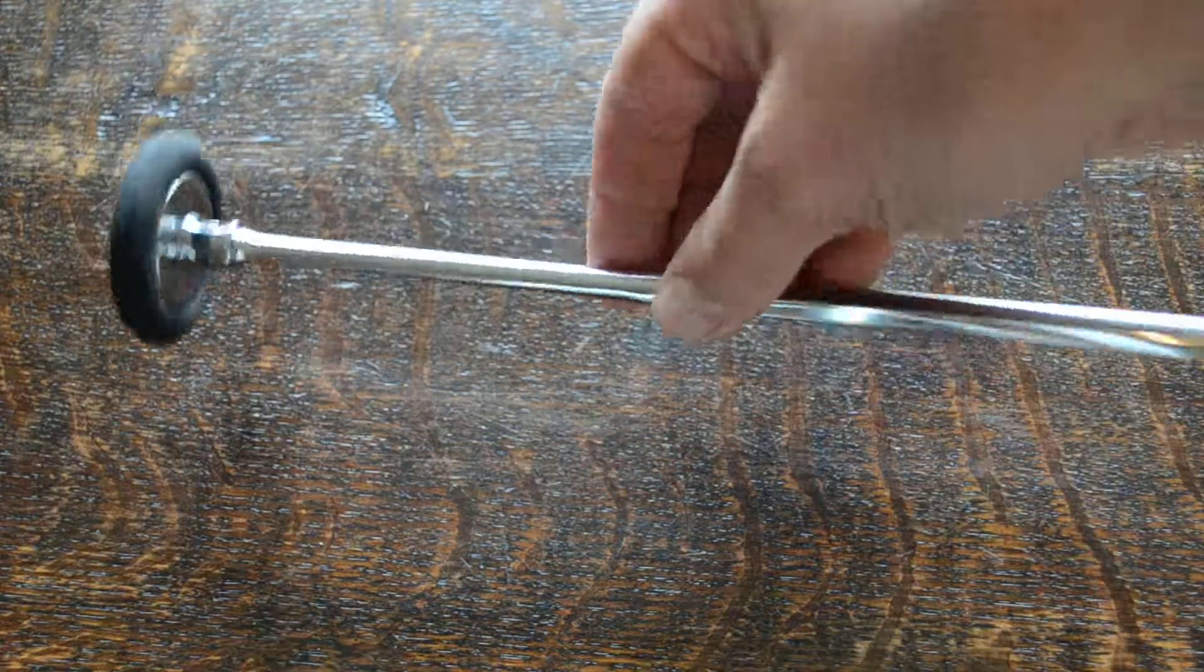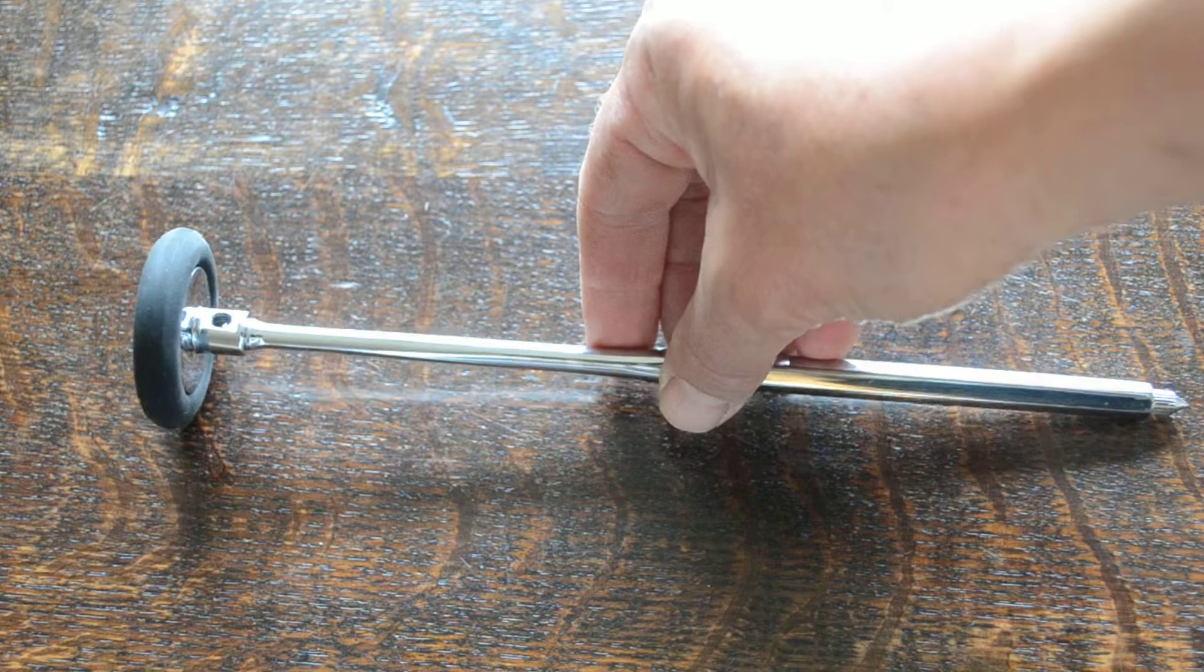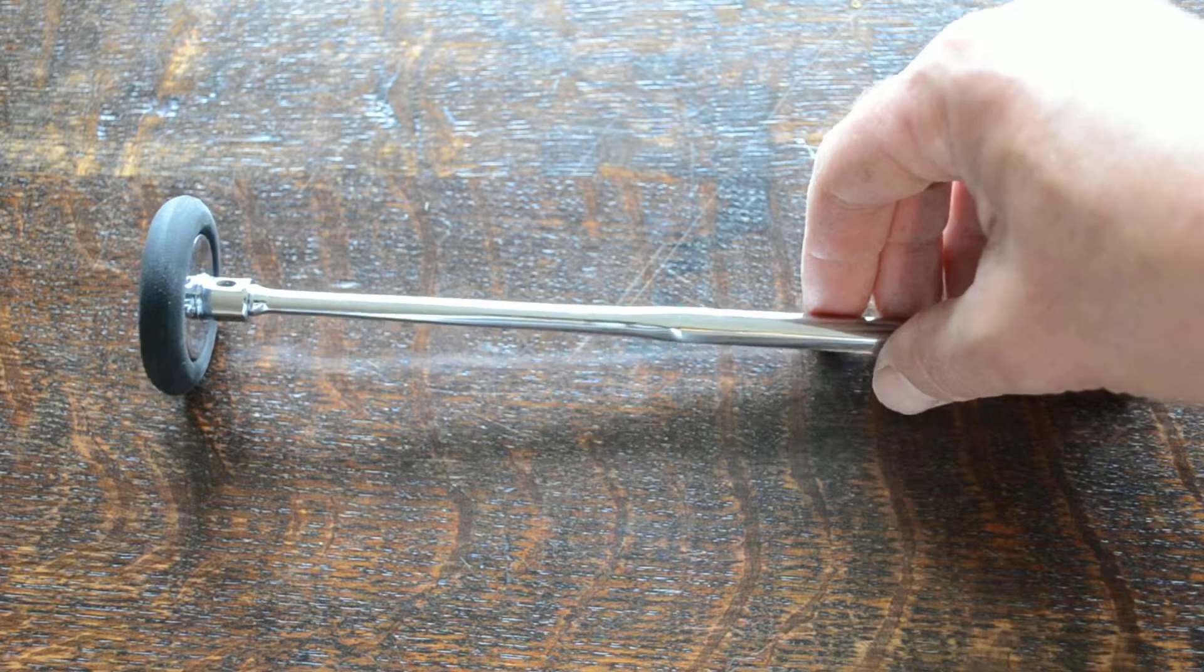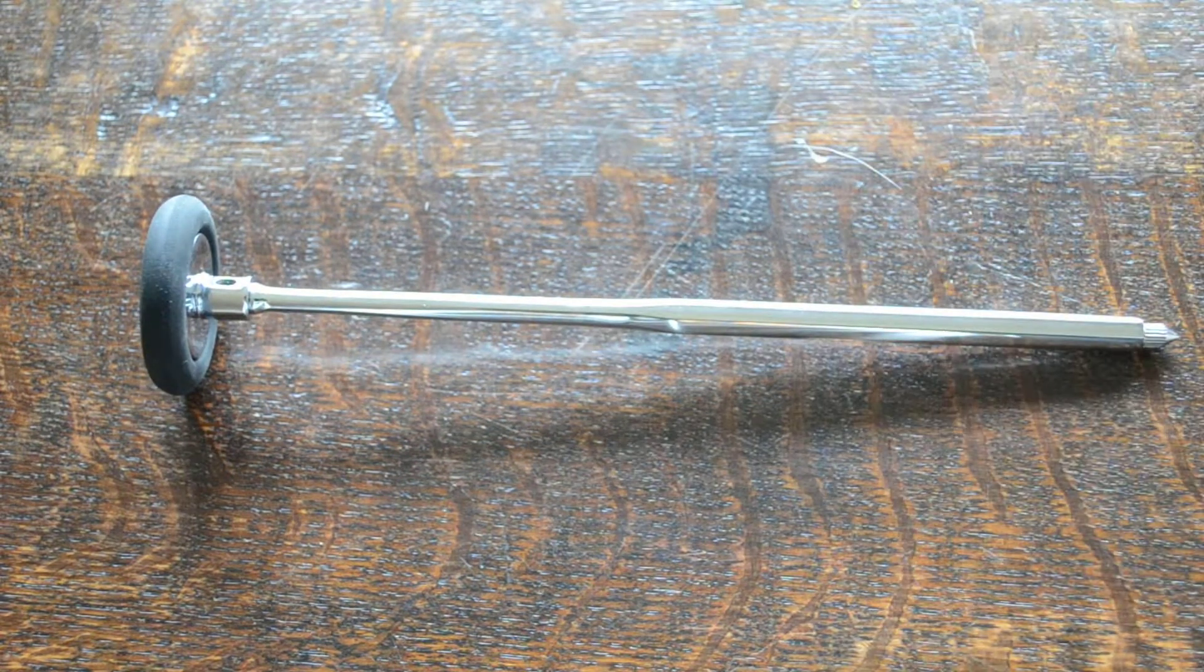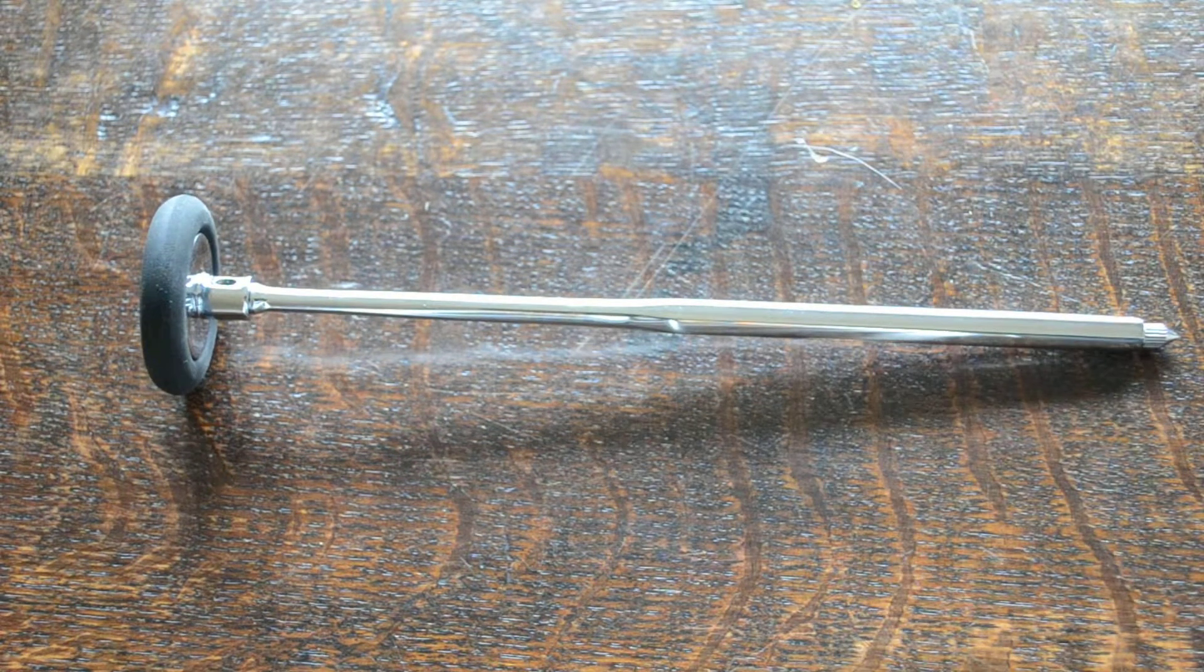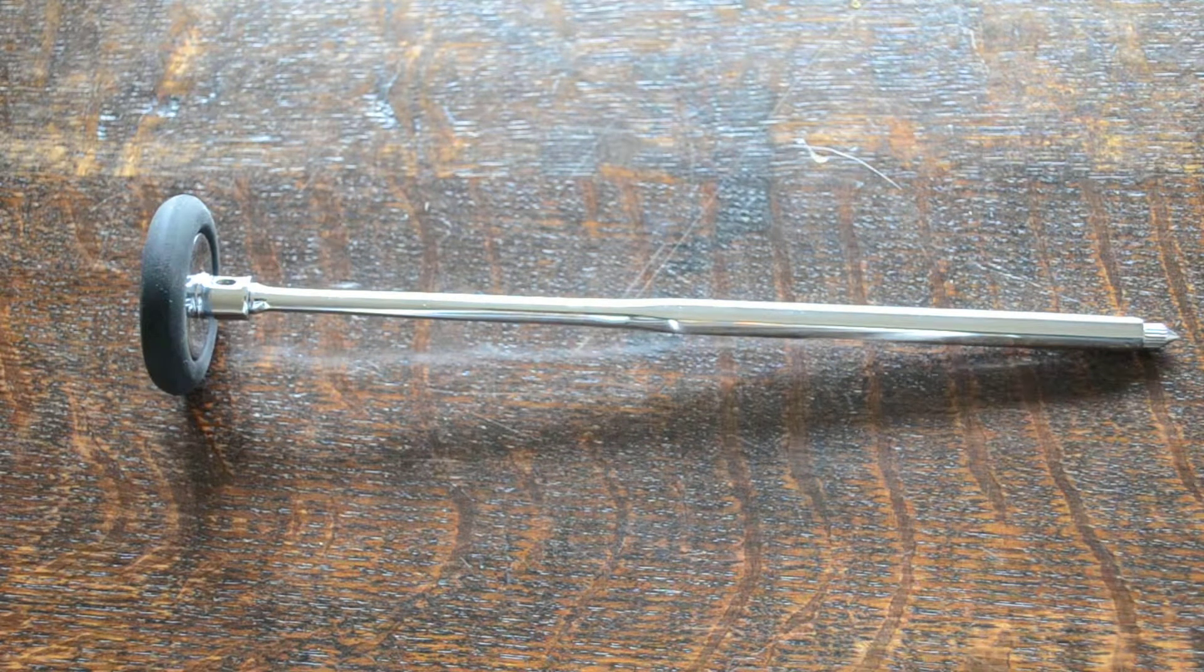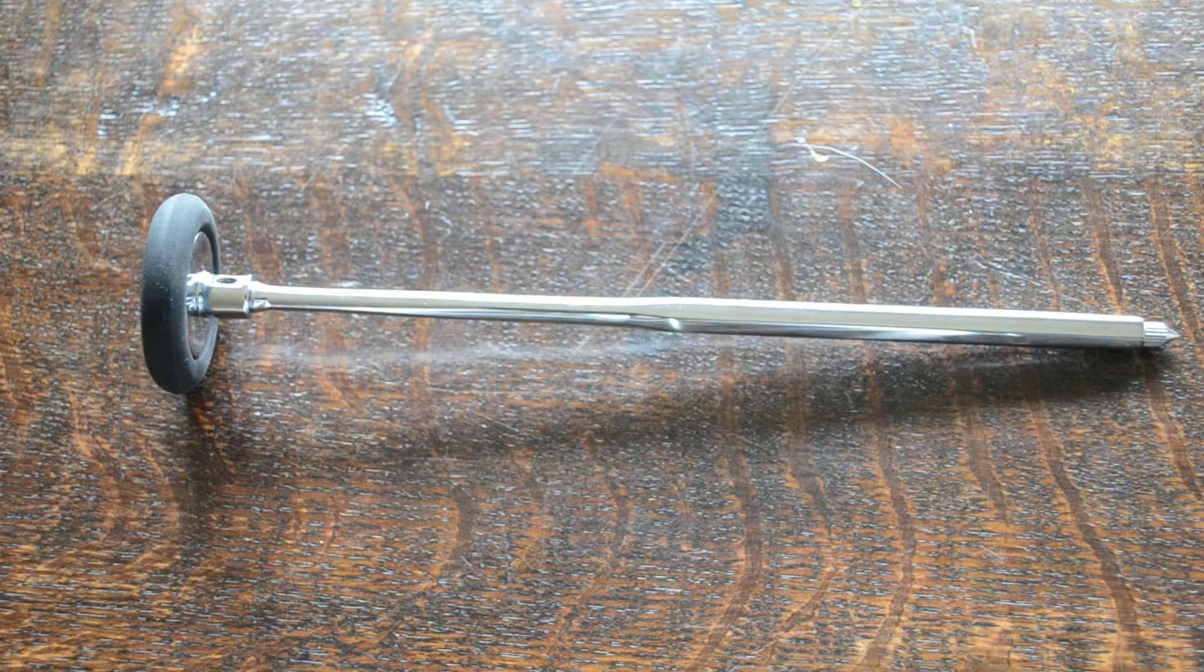It's a really good weight. Good quality hammer. Retails from the ValueMed website for about £7.95 plus delivery, excellent value for money and should last a long time.